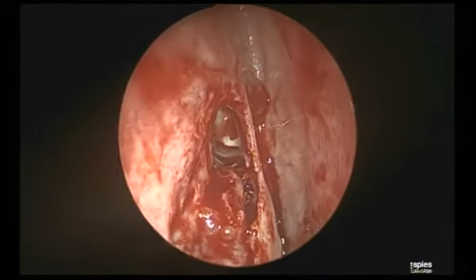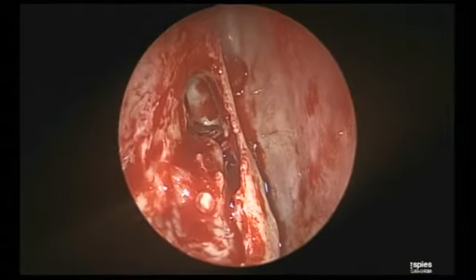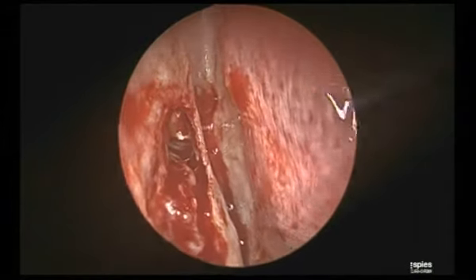The first. I'll remove the upper part to show you exactly the insertion of the upper part of the bulla. That is most important to be seen. Once you see that, that's it.